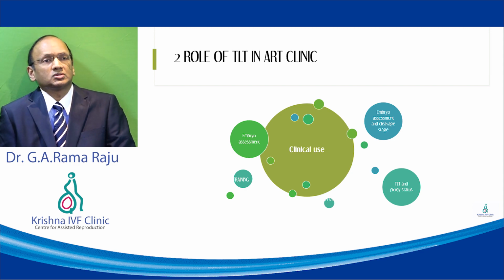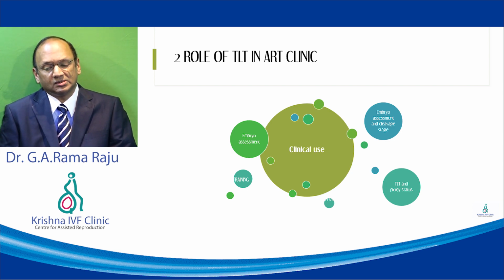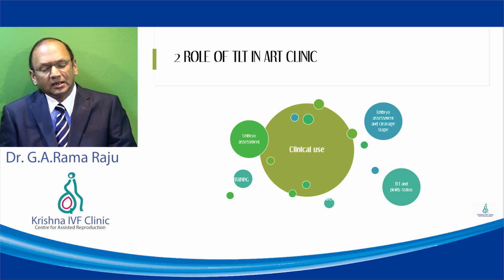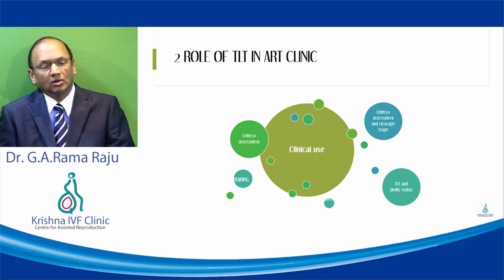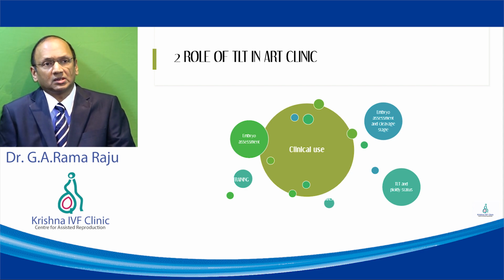It is also used to train the embryologist so that there is less observation bias, and an average embryologist can become a top class embryologist with the use of time-lapse technology. And the other area is that there is a whole world of opportunities to do research in the area of time-lapse imaging, because it is still in the nascent phase.